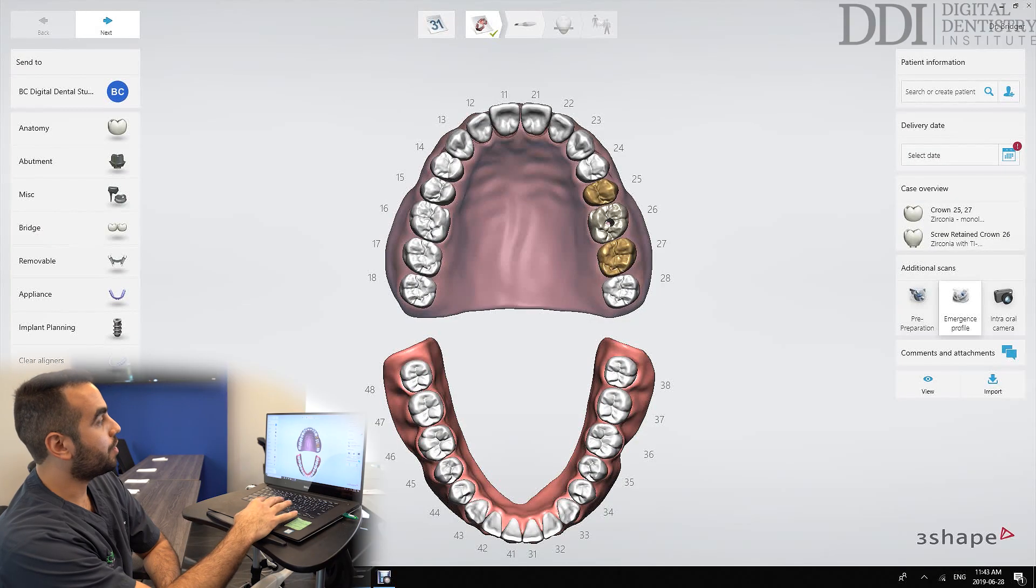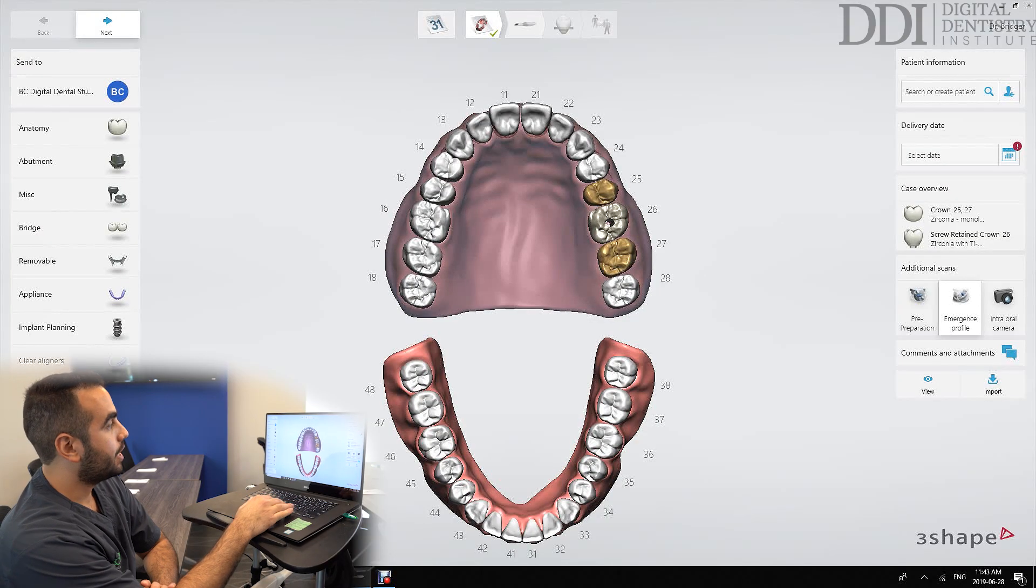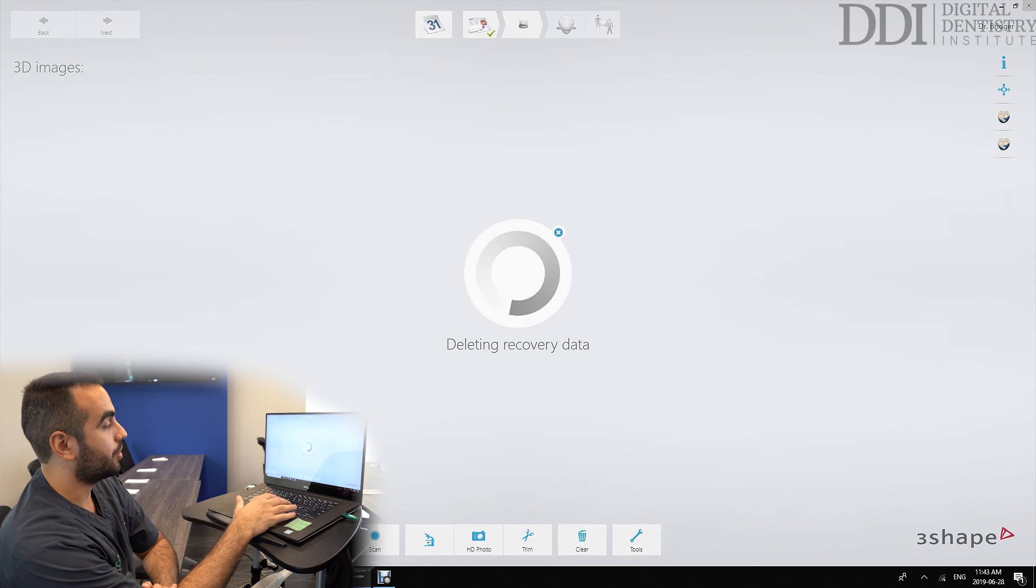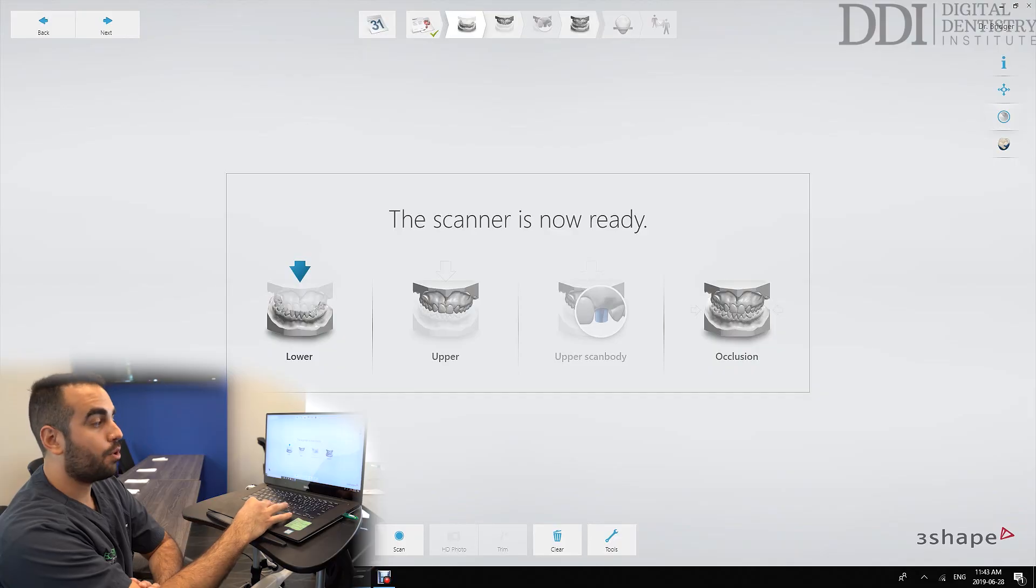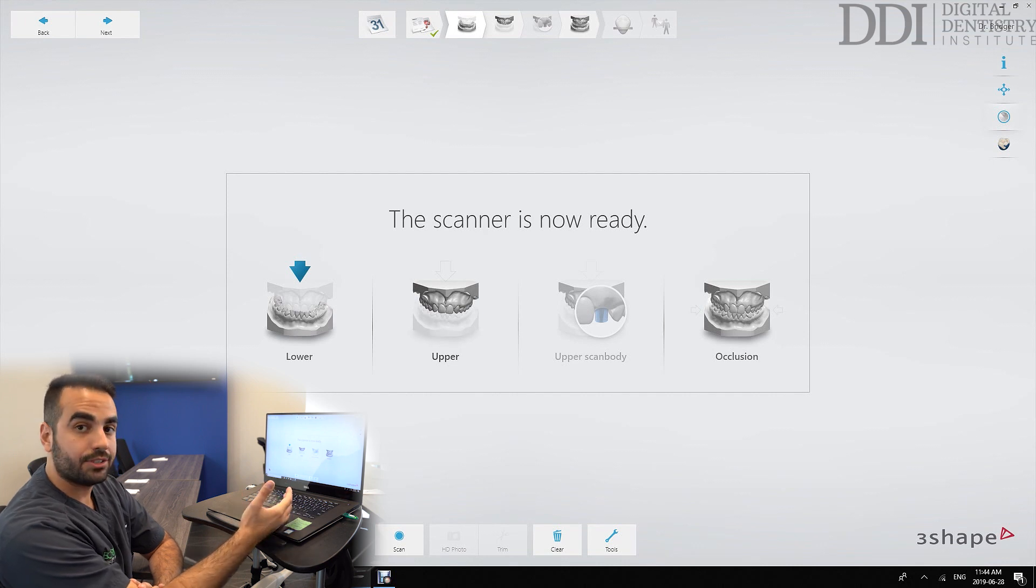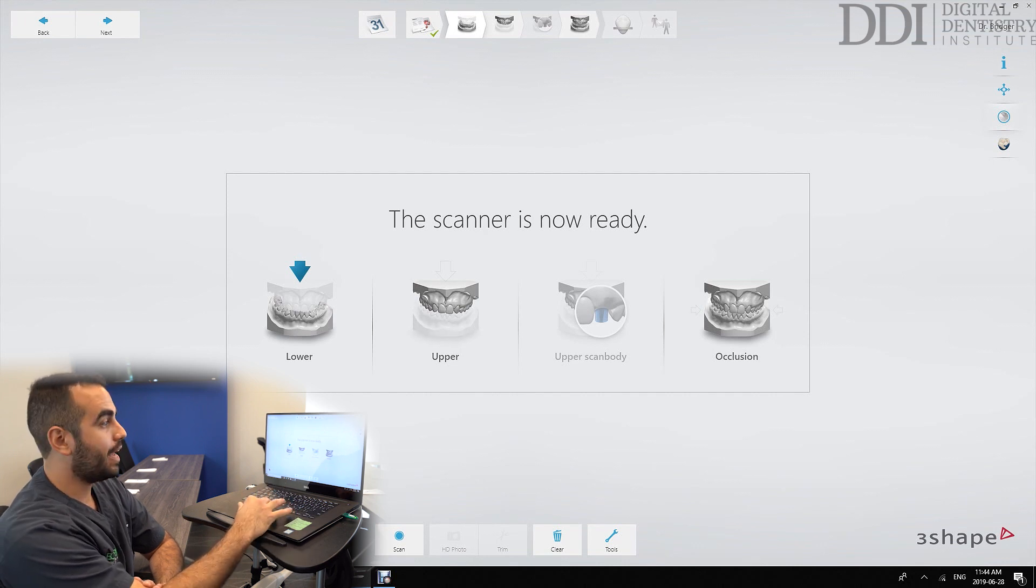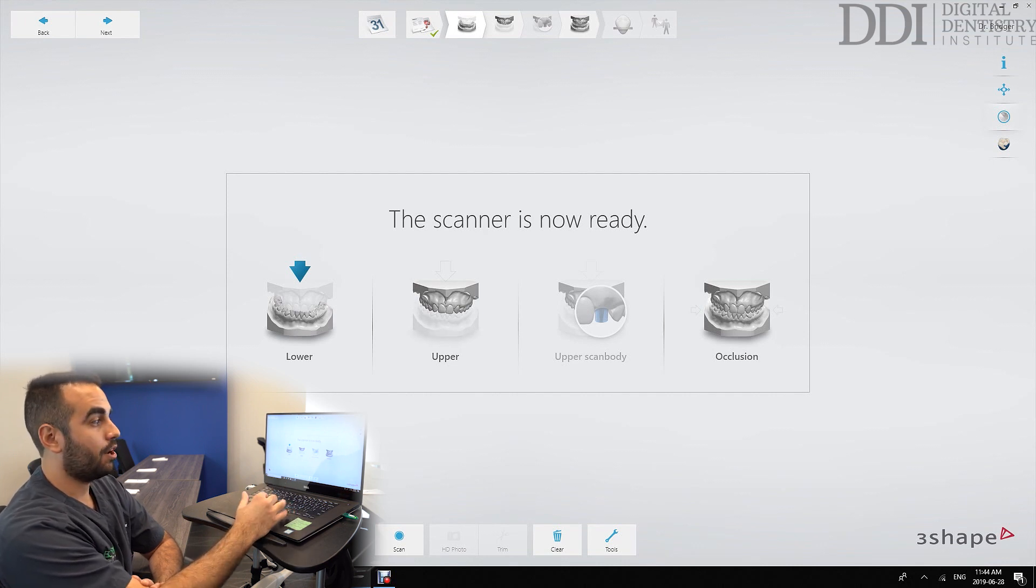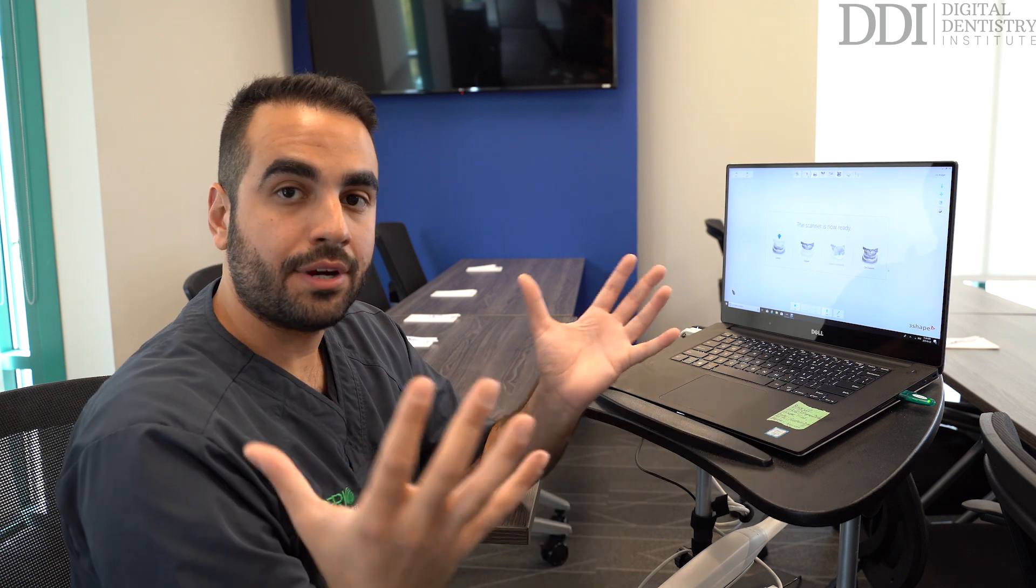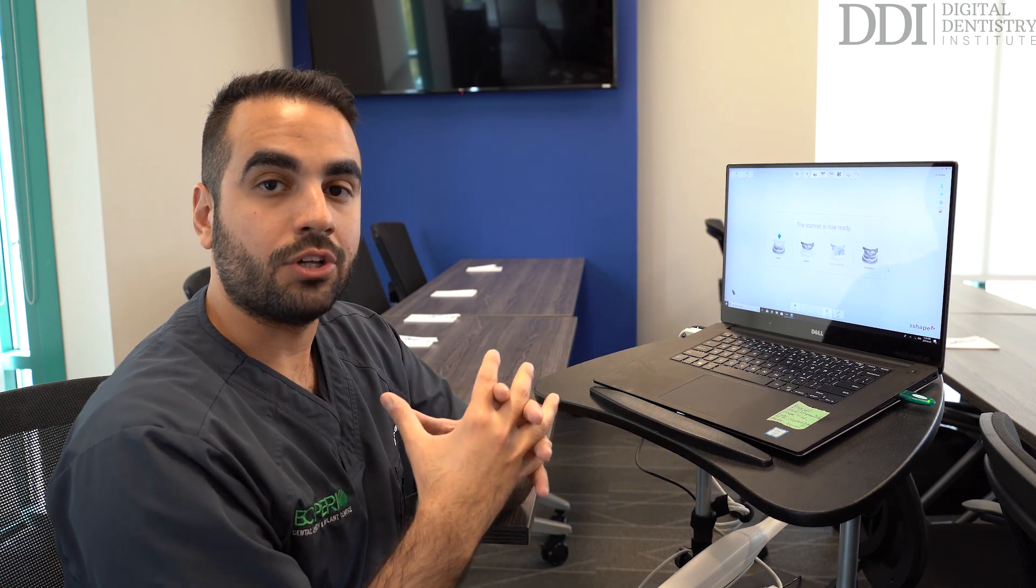We can then go to the next screen and what will pop up is the actual scanning screen. So what we'll see here are these scans that we've indicated. We have an opposing scan, a scan of the arch that we're interested in, and then a scan of the scan body. Then we take our bite scan to bring everything together in the correct jaw relationship.